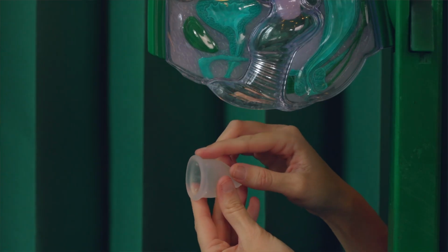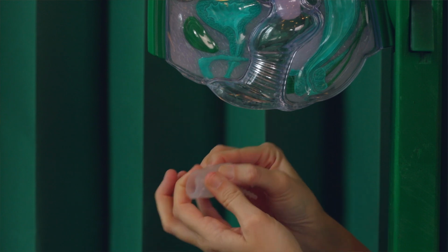I always loved the punch down fold. It's certainly the best for first time users. I'd recommend if you're new to cups to look up our menstrual cup fold tutorial. We show them all, but punch down is certainly my favorite. There's also the C fold, and there's all kinds of wacky ones, but you want to cycle through. If the cup's not opening for you in one, a different fold might work, but it does mean learning different techniques.